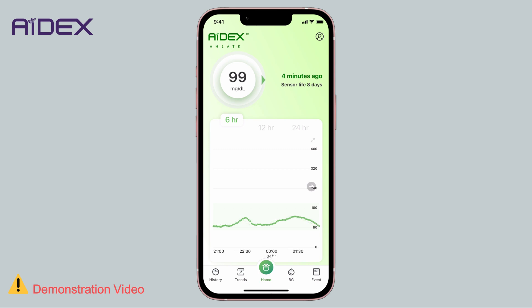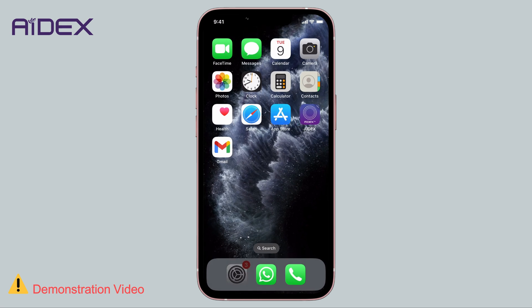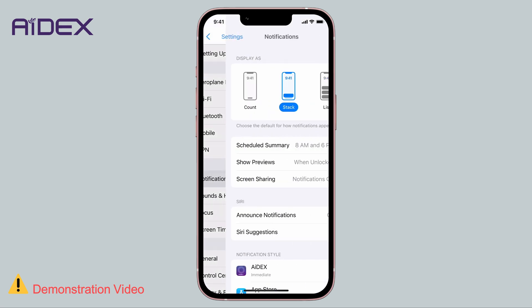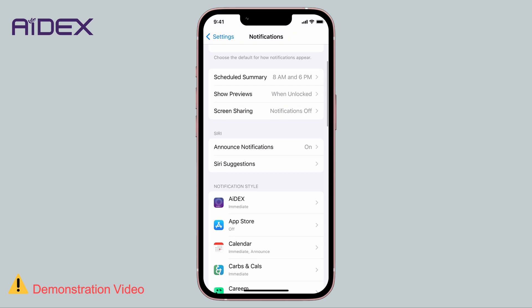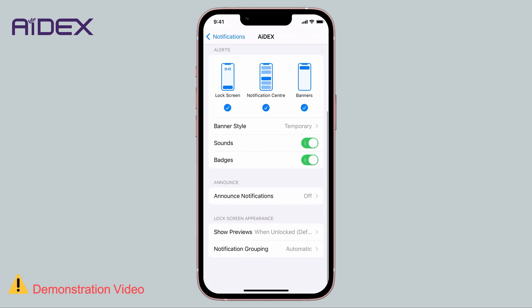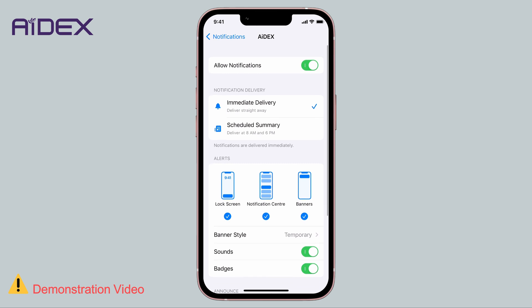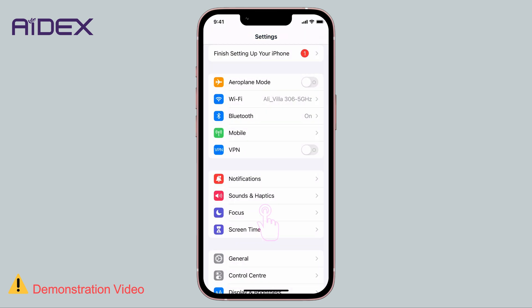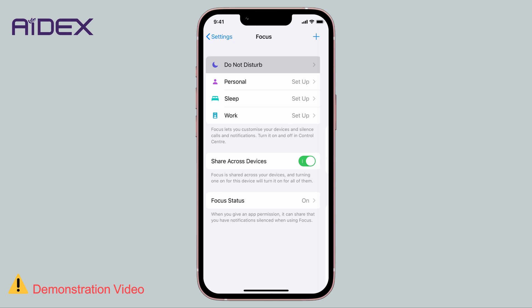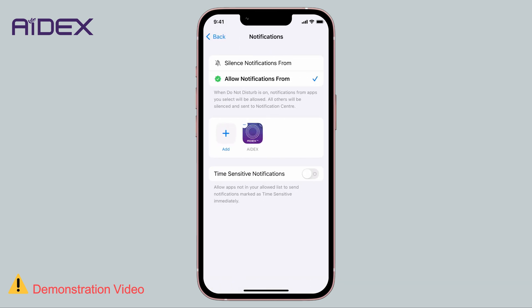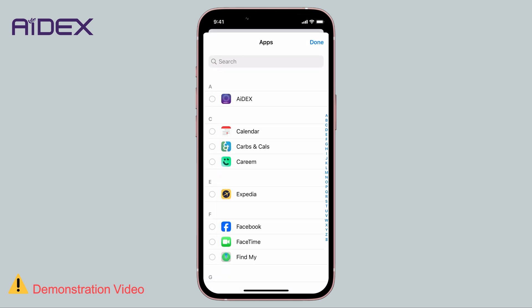Ensure that the notifications for the application are enabled and that it is listed among the allowed Do Not Disturb apps. From your mobile settings, tap on Notifications, search for the application, and select 8X. Ensure that all notifications are allowed. Additionally, select Focus, then Do Not Disturb apps, and make sure 8X is in the list. If not, add apps and mark the 8X app.